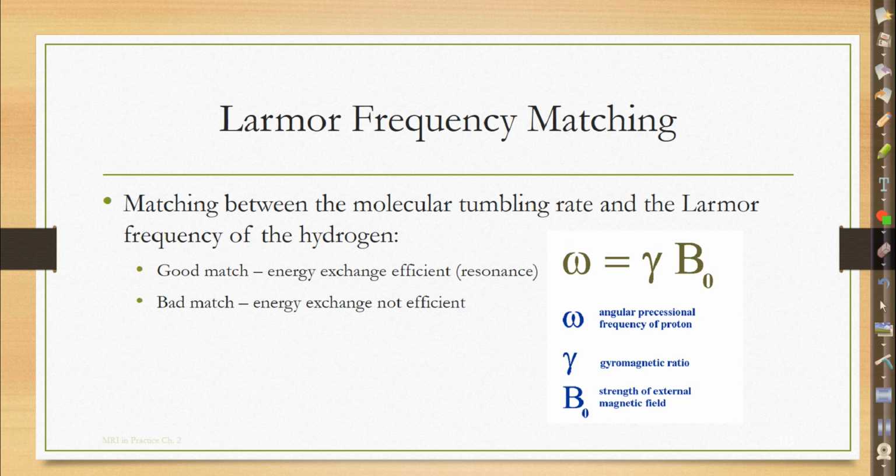When we say tumbling, does that just refer to the precession? No, it's really just the molecule in general. So do you think fat or water has a higher tumbling rate? Basically how it turns over. Say you have the two beakers, and fat is divided up into a bunch of different molecules of fat. Which one do you think tumbles faster, fat or water? Just thinking about the makeup of it. Water. Water actually tumbles a lot faster due to its properties than fat.